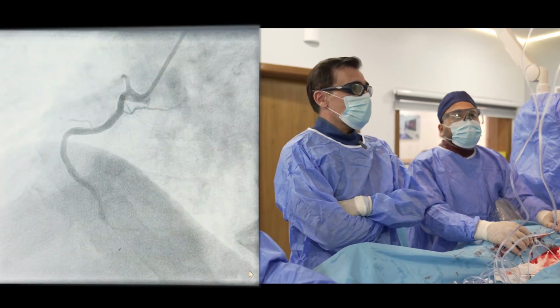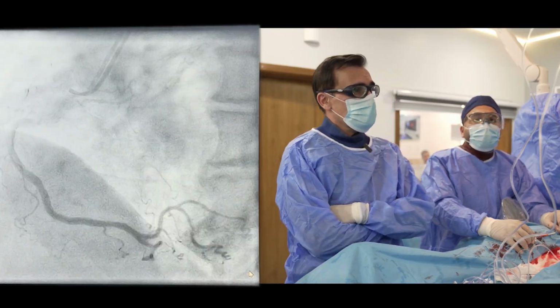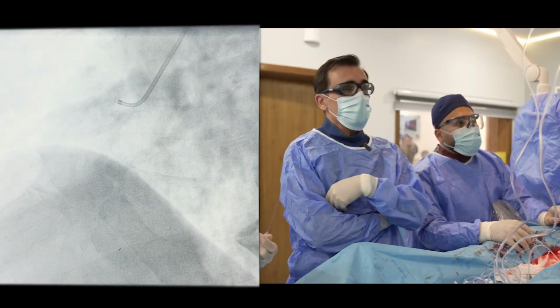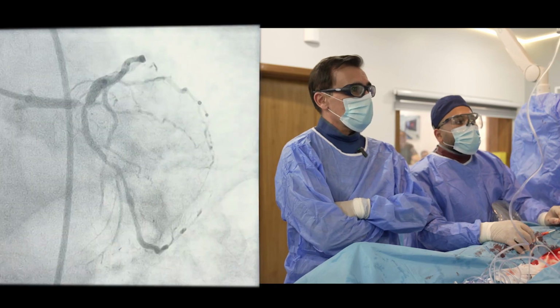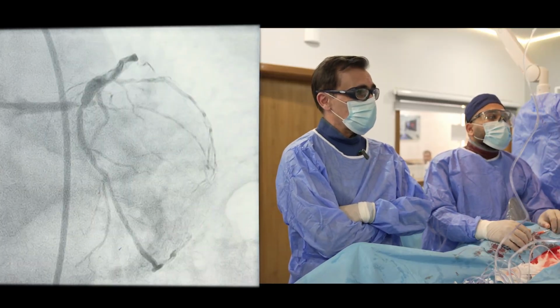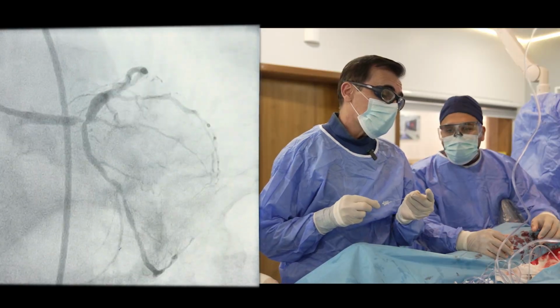We start the case. Dr. Ali Khalid did angiography, and he managed to engage the right coronary, which was not engaged by the radial approach. And there seems to be only an ostial plaque without a critical lesion. We took an EBU guiding catheter, 7 French, femoral approach. It's the same lesion as we discussed, the bifurcational distal left main stem with calcification. So we will start to take a Sion Blue wire, trying to engage first the left main LAD.